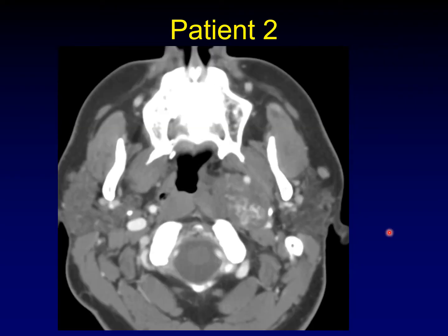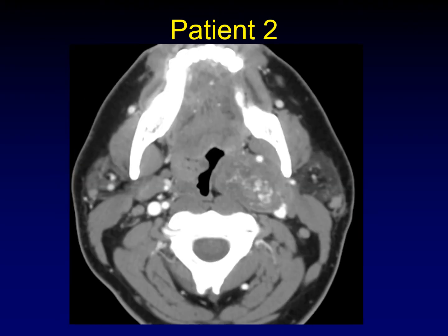Here's patient number two. Again, look at the surrounding anatomy and decide where you think this originated and what you think it is. I'll give you the jugular vein — it's right there. It can be hard to distinguish from the rest of the mass, but it's easy when you look at sequential images. Another picture of the same lesion — now the jugular vein is a little easier to identify, a little lower down in the neck.